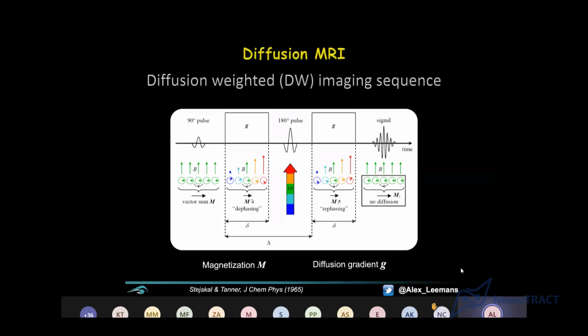So remember with MRI, in the beginning, I told you we would be looking at induced tissue magnetization effects, relaxation effects. And different tissue types have different relaxation properties. Well, if you add on top of that sequence another acquisition aspect to it, meaning that you send in a 90-degree RF pulse, all these spins basically get flipped, if you want.